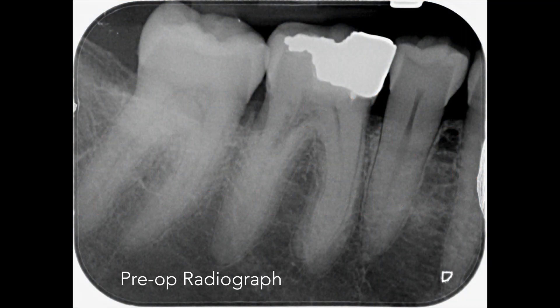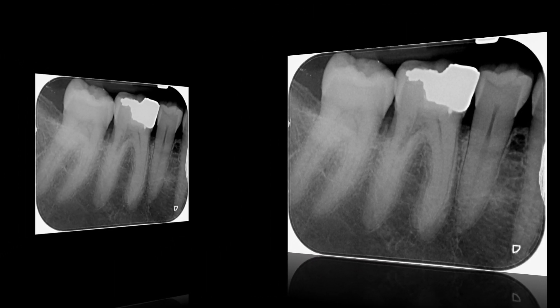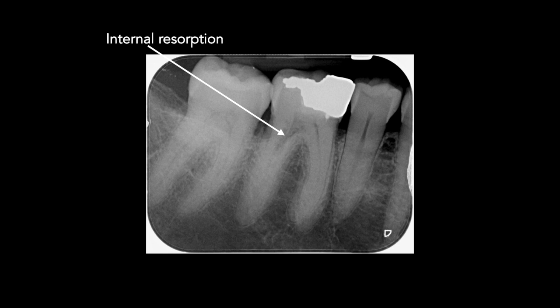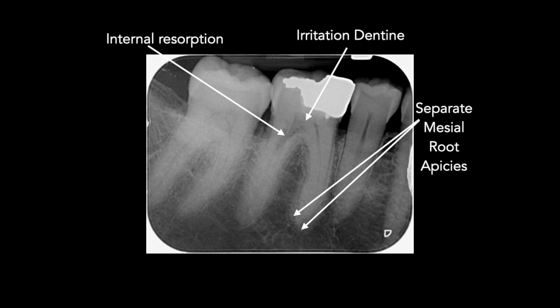Here you can see the pre-operative radiograph of the mandibular right first molar. The tooth was still vital but was symptomatic. It's been restored with an amalgam restoration. The pre-operative radiograph shows an area of internal resorption on the distal root. You can tell this is internal resorption firstly because the tooth is still vital, but there's no ghost area of root canal superimposed on the area of resorption. The canal shape has been distorted. There's irritation dentine in the pulp chamber and two separate canals in the mesial aspect.